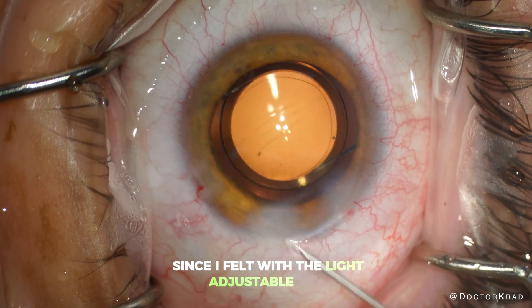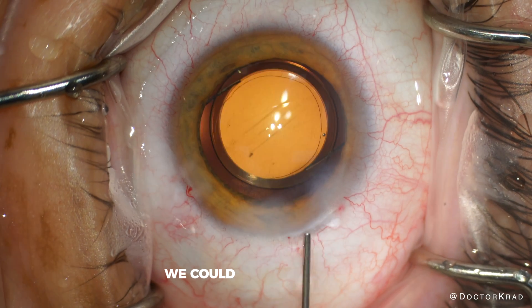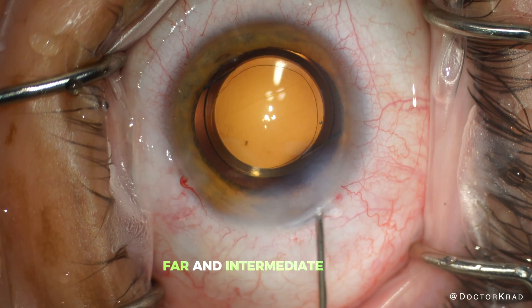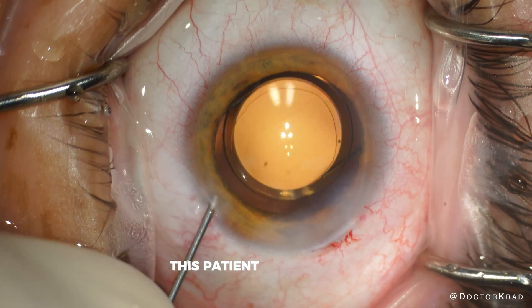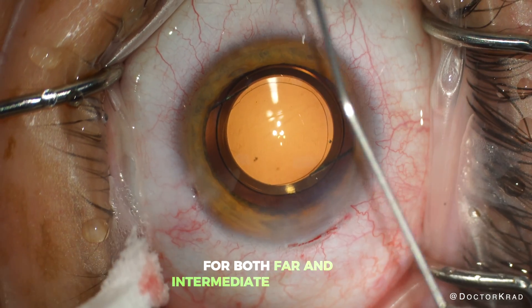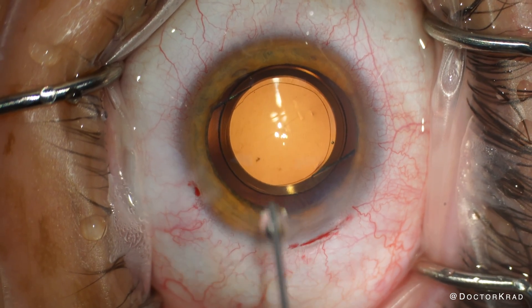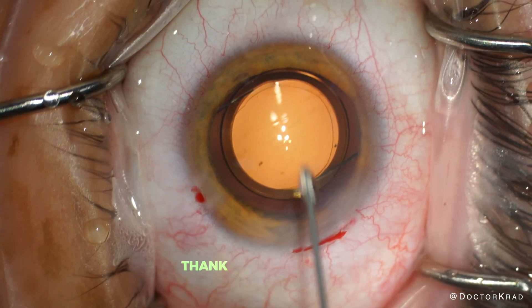Since I felt with the light adjustable lens, even with both eyes targeted for far, we could achieve excellent far and intermediate range vision. This patient did great and achieved 20/20 vision for both far and intermediate range vision. He only needs readers when reading very small print. I hope you found this video helpful — thank you so much for watching.